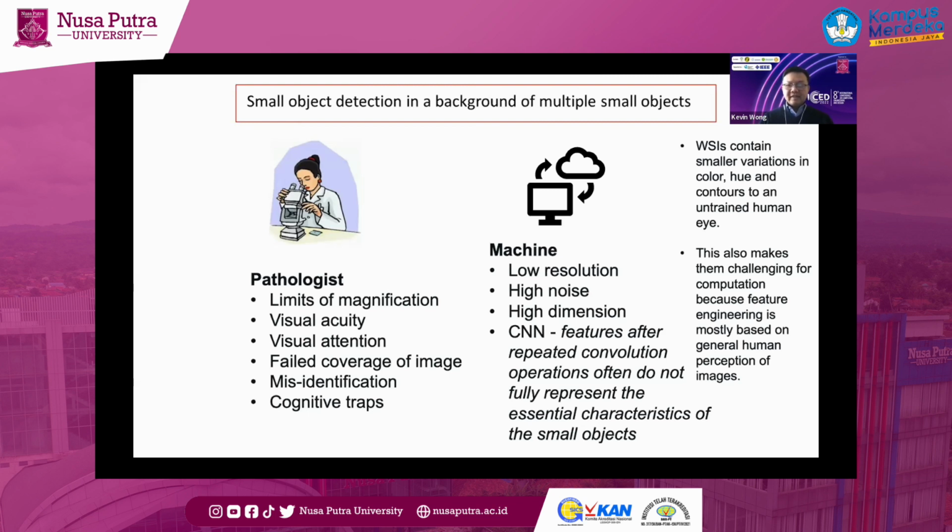And then you look at the machines. When you look at the machines, you know that sometimes you will have to deal with noise. The challenge here is high dimensionality, because the image is huge in terms of gigapixels, and you can zoom in and zoom out and so on. That is one of the challenges. All of this has contributed to the challenges we have seen when using the WSI.